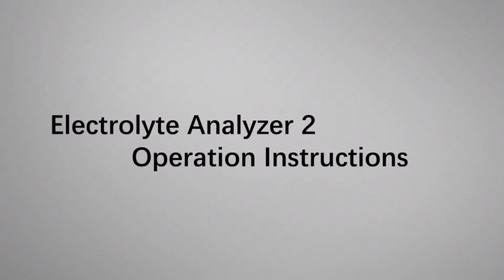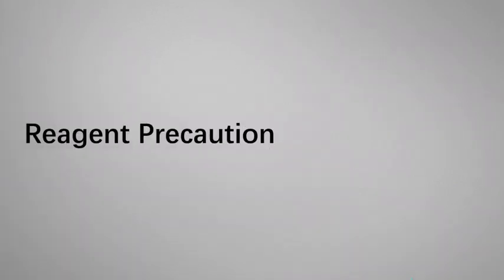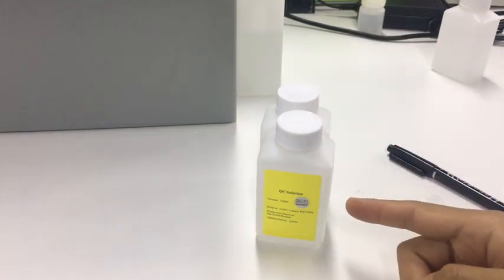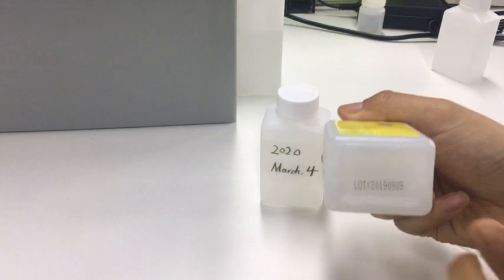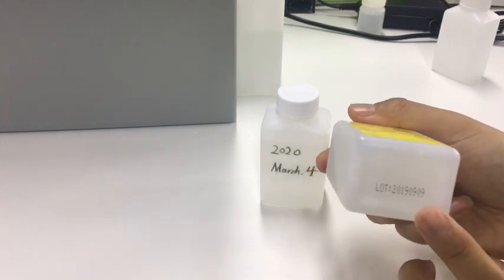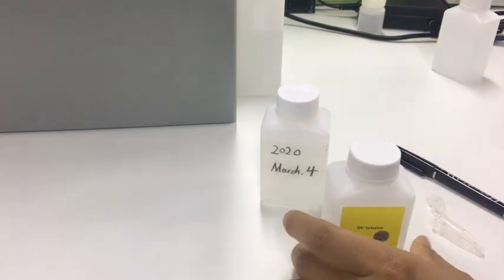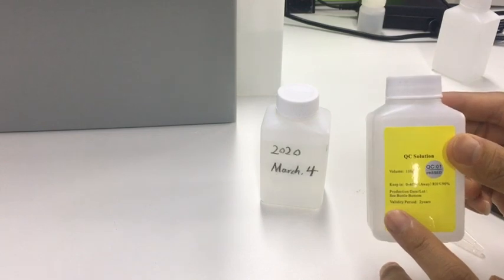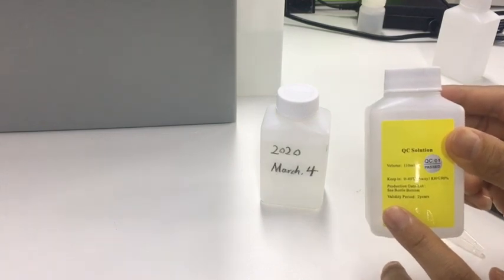This video will show how to operate the electro analyzer. This is the reagent that comes with the machine. We can check the lot number at the bottom of the bottle. The warranty period of the reagent is two years before opening.